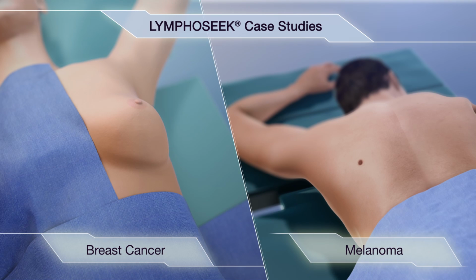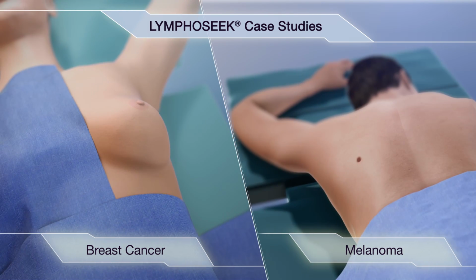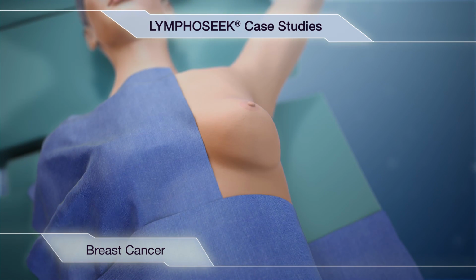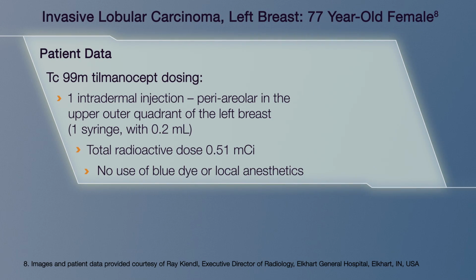Now let's look at 2 actual patient case studies that utilized intradermal injections with Lymphoseek. We will begin with a breast cancer case. The first patient is a 77-year-old female with invasive lobular carcinoma of the left breast.